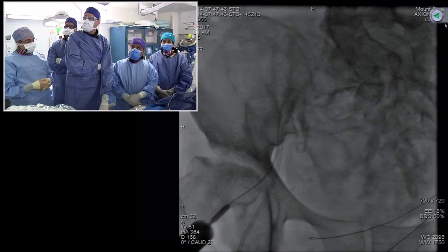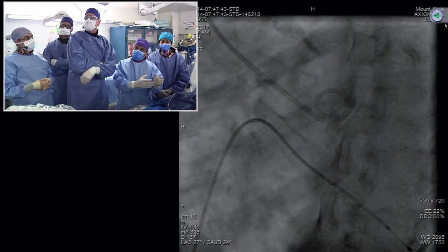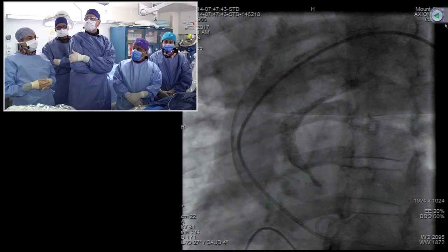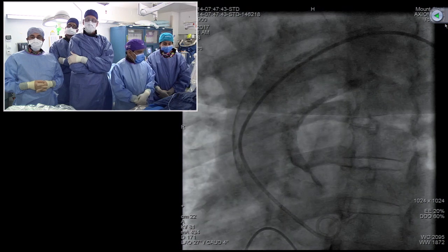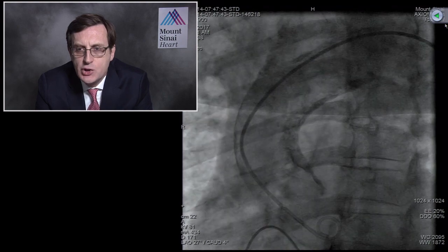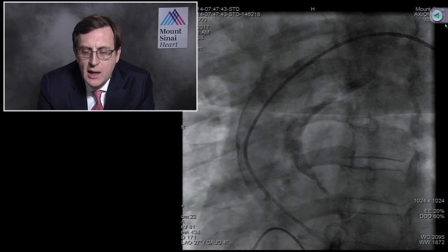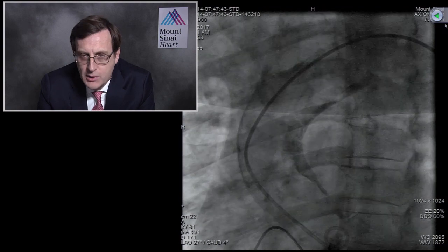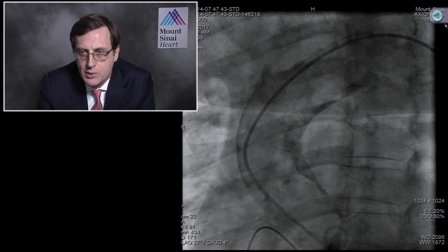Even in many of these calcific vessels, the vessel hugs the sheath. Even once you have put the sheath in, it's no guarantee that your valve is going to go. It will still give a lot of resistance there. We're anticipating a bit of a push to get the valve up through the sheath in this particular case. Okay, we are ready. I just need to clarify that there is an absolute contraindication for use of any embolic system here, because there is incredibly high risk of causing embolization during placement of the embolic protection system, no matter what it is. And all such cases were excluded by the embolic protection trial.